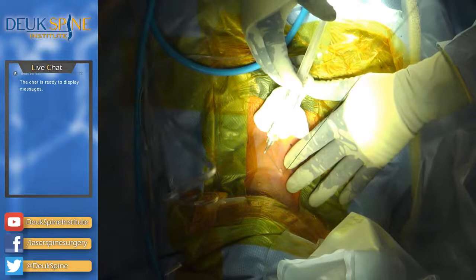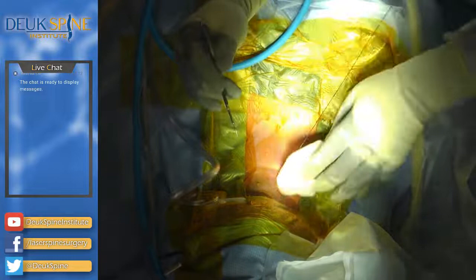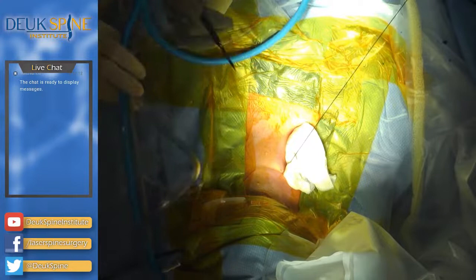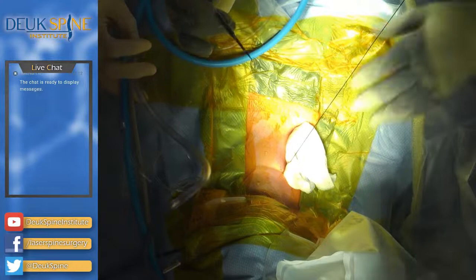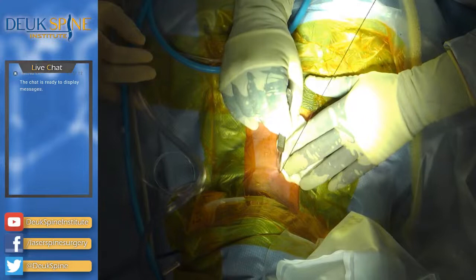I've injected some medicine into the skin. Why would I do that? Because this medicine has numbing medicine in it, so it doesn't hurt the patient when I cut him. Even though he's asleep, he could still feel it and respond to the pain subconsciously. His blood pressure could go up, his heart rate could go up. So we still numb up the skin even when people are under general anesthesia to avoid reflex responses to pain, which are controlled by the brainstem.